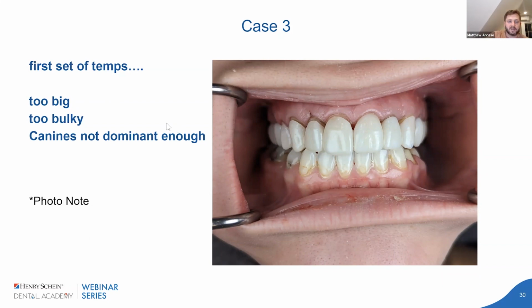I have photos of her face, and I put this note in here to talk about a procedure protocol that we just added to my office. Because what would happen is we have this light box where with your cell phone you can take all these high quality, great photographs. It's not with the DSLR, it's not with the big camera setup. It's with my assistant's iPhone. So when they take patient photos with iPhones, they just send it to the lab and delete it because they want to leave work and not care about teeth and leave dentistry alone.